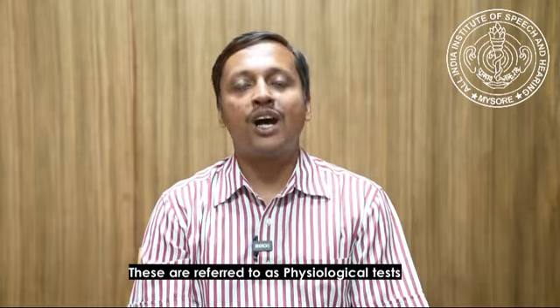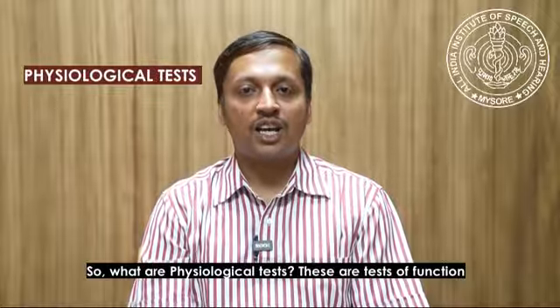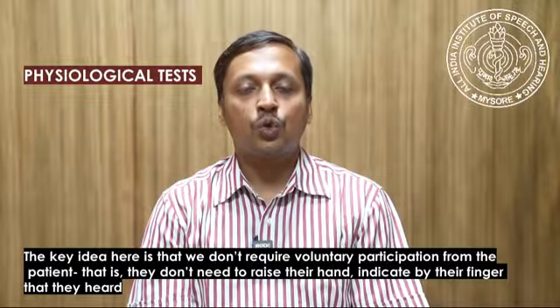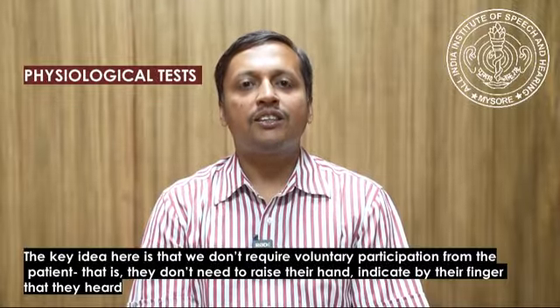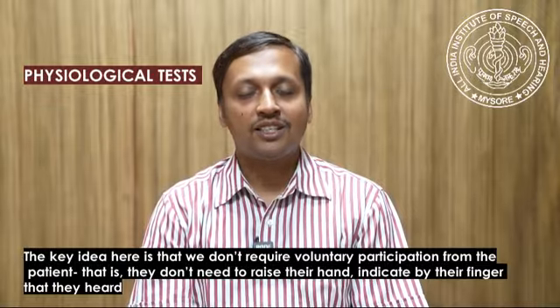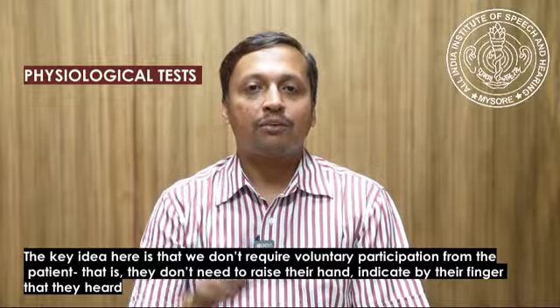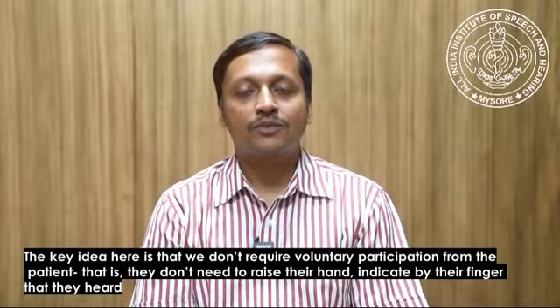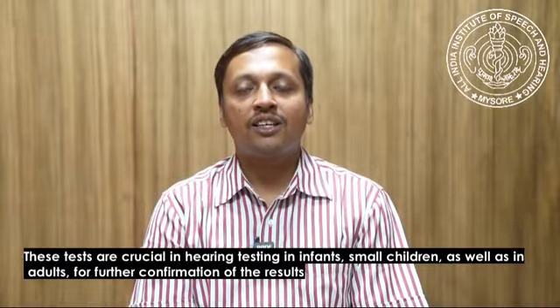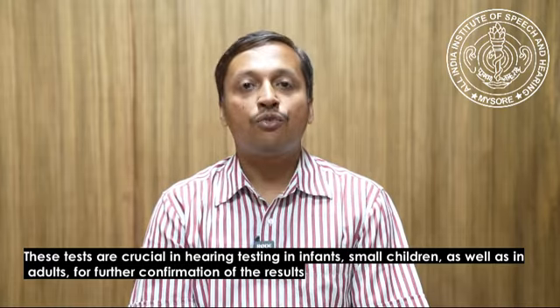These are referred to as physiological tests. So, what are physiological tests? These tests are tests of function. The key idea is that they do not require voluntary participation from the patient, that is, they do not need to raise their hand or indicate by their fingers that they heard. These tests are crucial for hearing testing in infants, small children, as well as in adults for further confirmation of the results.